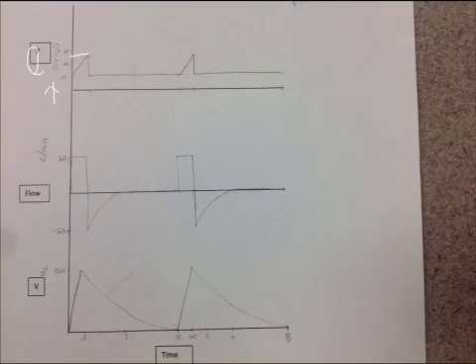On the bottom here, we have our time scale done. So we see here that the inspiratory time, or the TI, was 0.5. That's labeled there, and that traces right up along to all of our waveforms matching up there. We also labeled here on the bottom our total time, which was 4 seconds for each breath.